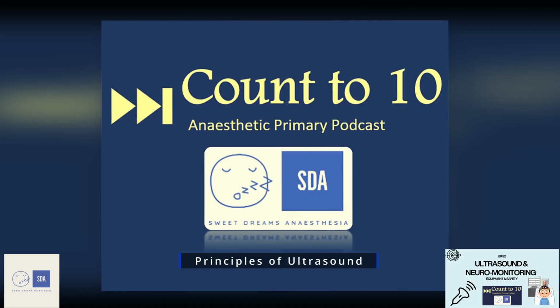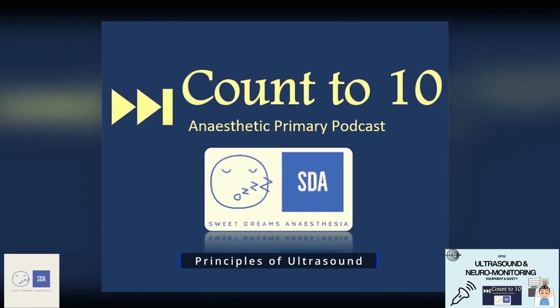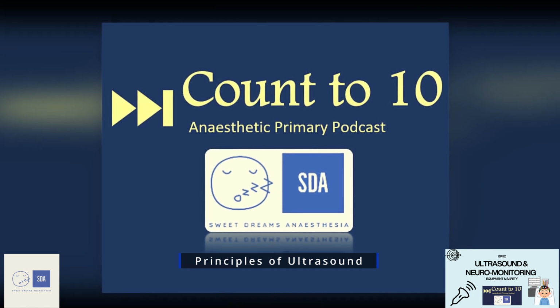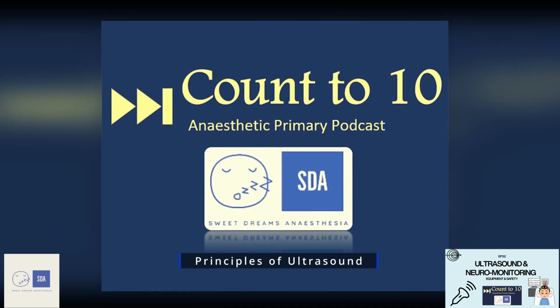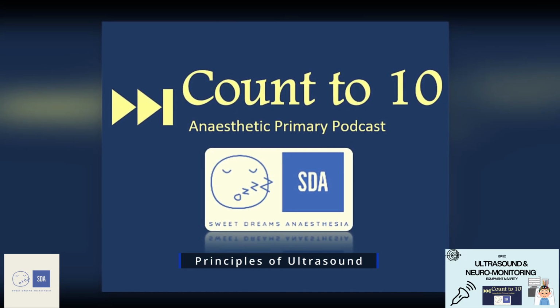And if you choose the wrong probe, there are some cheats you can use within your ultrasound machine to optimize imaging. The classic setting that you might be aware of is gain. And gain is essentially turning up the return signal of those ultrasound waves coming back and being reflected to the probe so that everything on your screen looks brighter. This allows you to temporarily see deeper structures, but at the cost, you may lose the ability to delineate between structures.